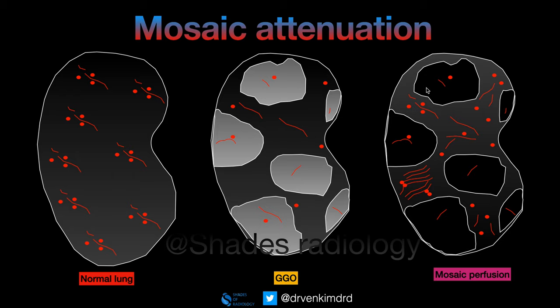Now this is the case of mosaic perfusion. If you see the vessels in the lucent areas of the lung showing decreased density — a decreased number of vessels in the lucent areas — then it is mosaic perfusion. With this image, you should be able to clearly differentiate what is GGO and what is mosaic perfusion.